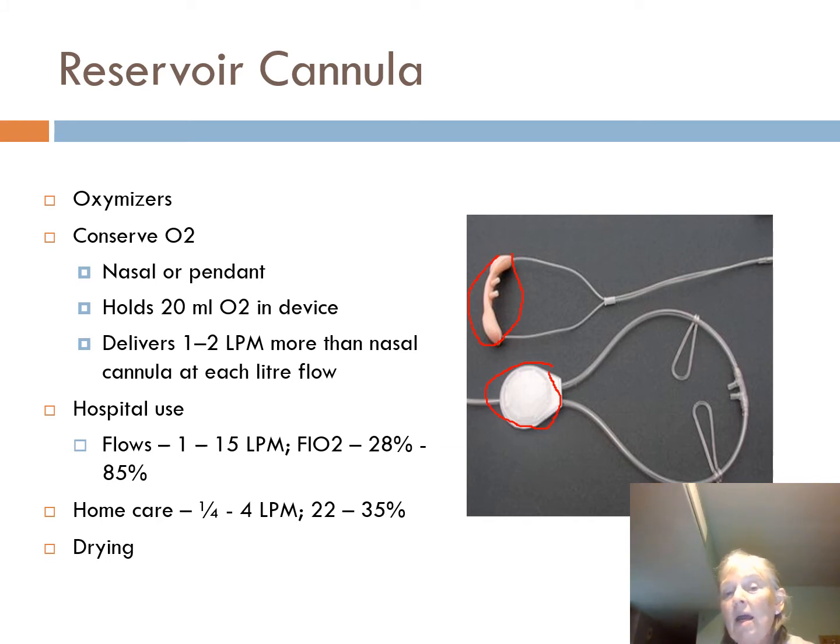When they do, it's now occupying space, and so there's less oxygen being stored. The other one you see, and you'll see it especially with this one, is if you start getting a lot of water up there, you're going to stop that oxygen that you need. Plus, it's a perfect breeding ground for any of the microbes that the patient may have in their nasal passages.